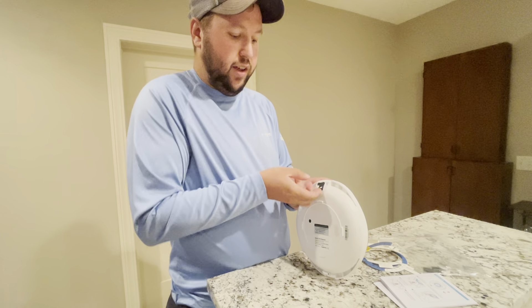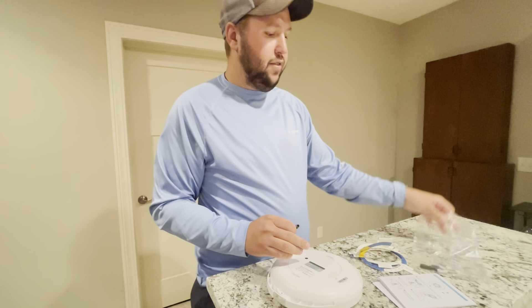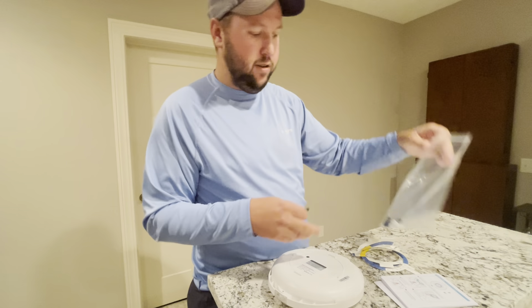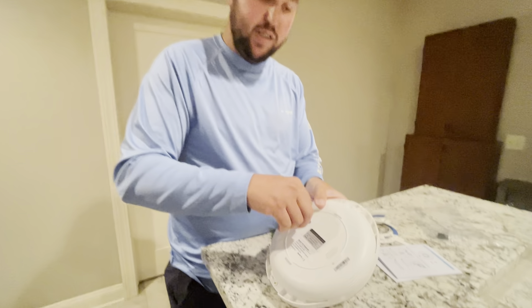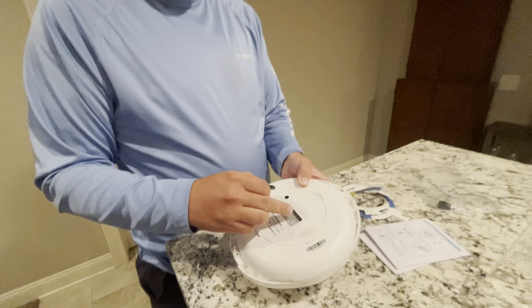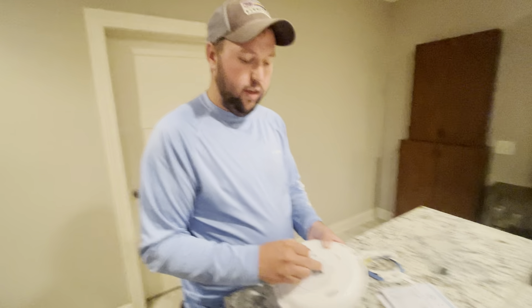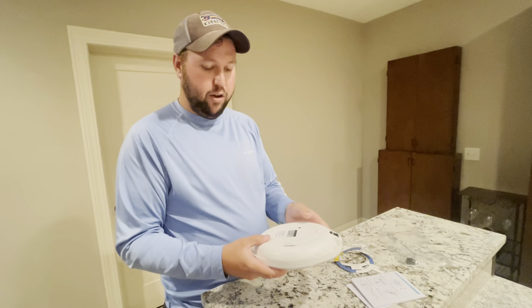it does come with three keys. It has this key and you can put the storage here. The extra keys are right here and they come in this bag. To unlock it, all you have to do is press this and this tab will come up — this is where your batteries will go. It did come with four AA batteries, so you don't have to worry about batteries.